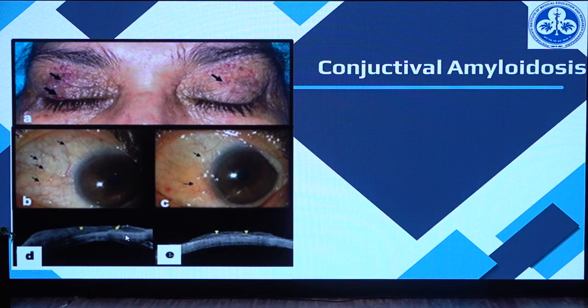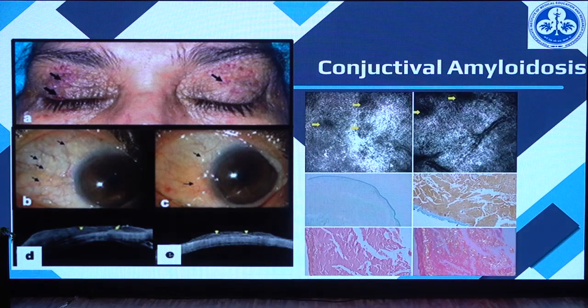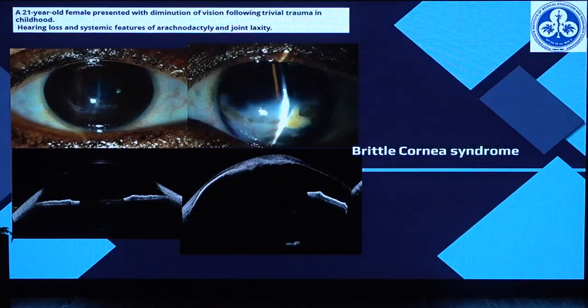On doing a biopsy of the conjunctiva, and also a confocal microscopy, we could see hypocellular, blob-like lesions just adjacent to the vessels. This is a vessel, and on doing a further biopsy, we found it was a case of conjunctival amyloidosis with apple green birefringence. We reported this case because the ASOCT can give us an idea about the diagnosis, preemptively letting us know, even before doing a biopsy, that the patient could have amyloidosis.